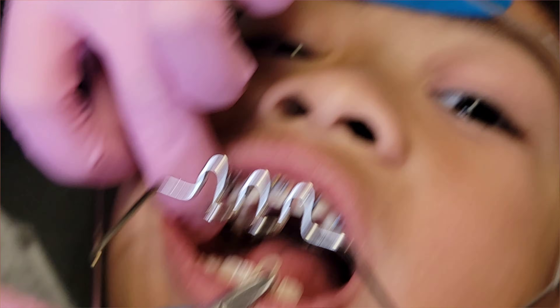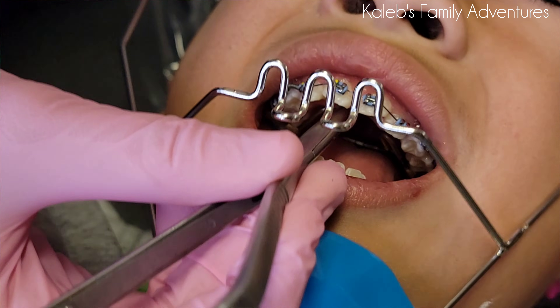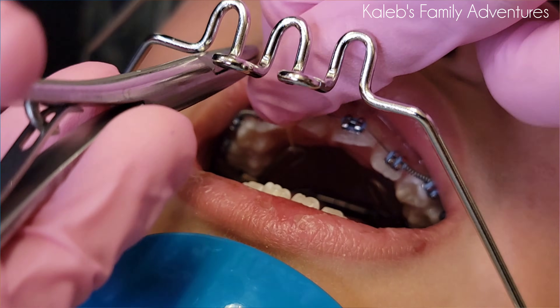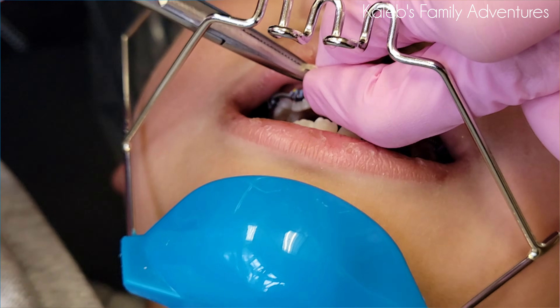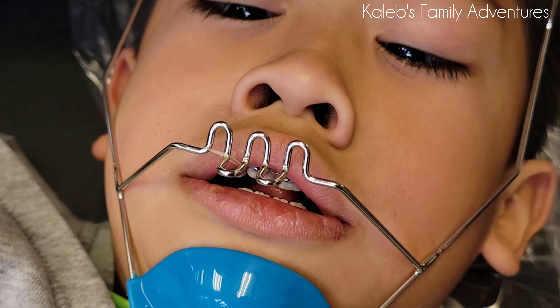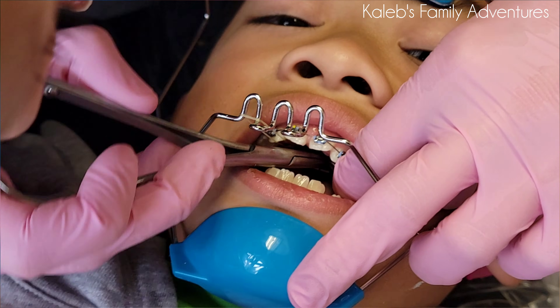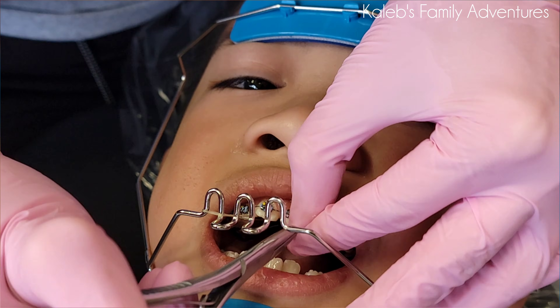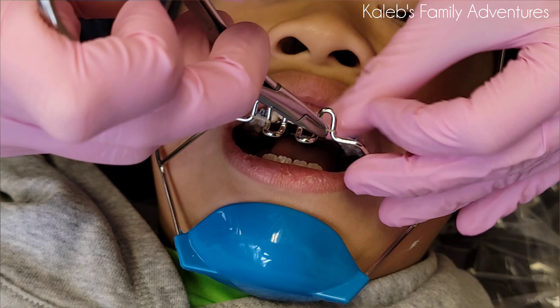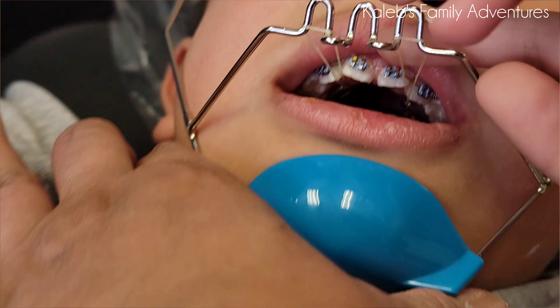You see these hooks that are on his appliance up here, right inside of his mouth? Close down, bud — we're gonna bring it to one of these, it's gonna hook around there, that's how it's gonna stay on his face. Open for me, bud — we're gonna hook it around here, and then you really can just pull these so he's gonna feel some pressure but it'll kind of stay on his face like that.